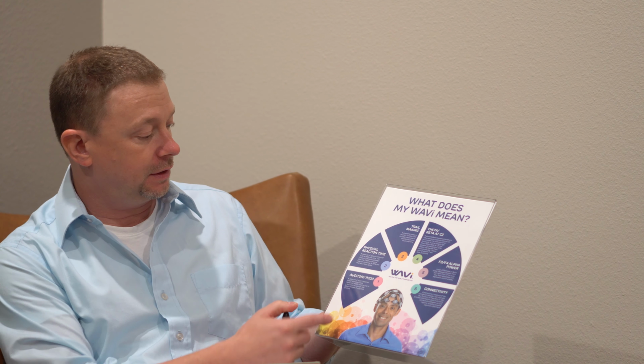Nick asked me to come and describe some description of the Wavi work, and we've got 6 categories here. Wavi does an auditory P300, which is a method of measuring an event-related potential, ERP.